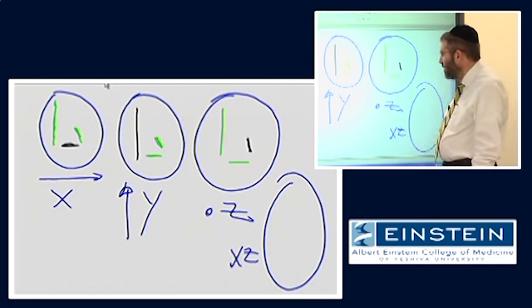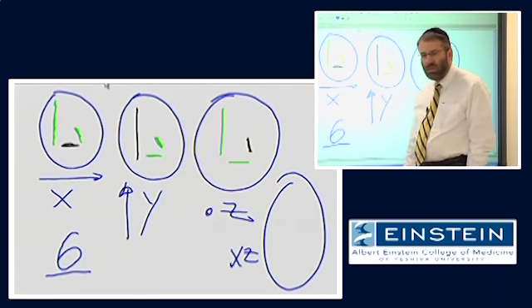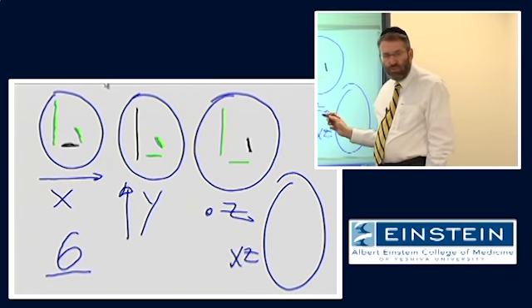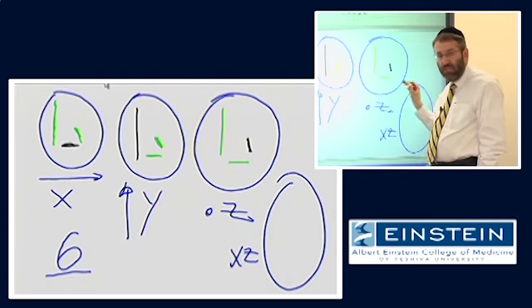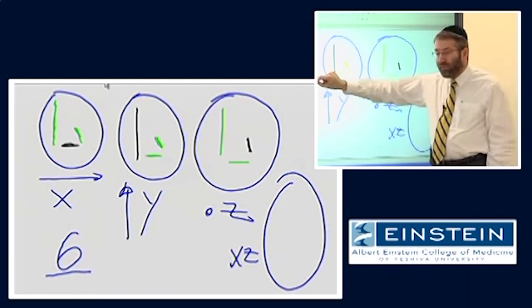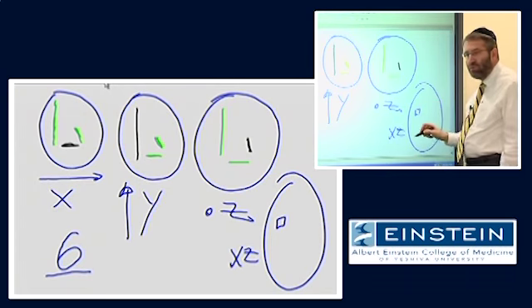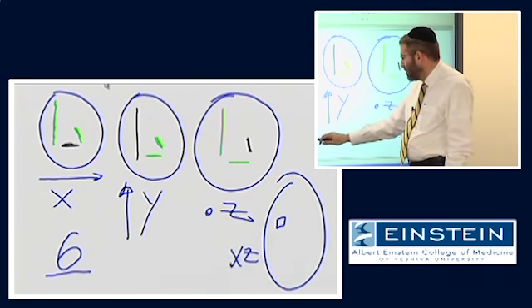So if we have a sufficient number of these images, and the minimum number is 6 unique directions along which we sensitize to diffusion, we can actually take each of those 6 diffusion-weighted images, in comparison to the B0 image, generate an ADC image for each of these, a quantitative diffusion-weighted image, and use that velocity of diffusion under each of these conditions to compute for each voxel what the 3D trajectory of diffusion is like in that location. Okay. And this is something called the diffusion tensor.